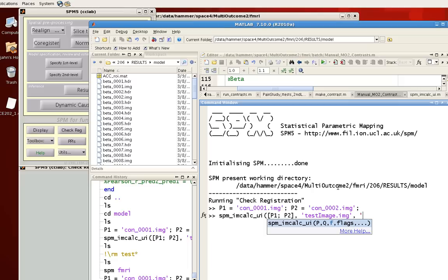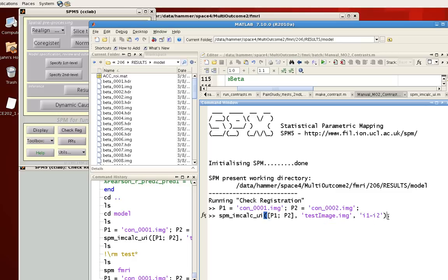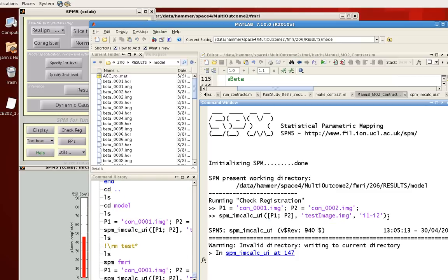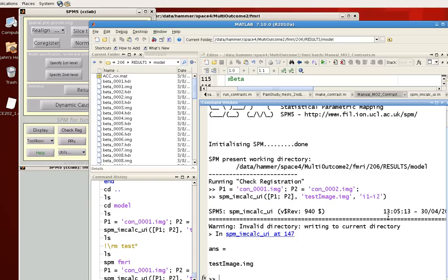And lastly, the actual operation we're going to do. And in this case SPM has a couple of reserved keywords. I1 for the first image you input. I2 for the second image. I3 for the third image. And so on. So just type in a simple mathematical operation. In this case I1 minus I2. And hit return.